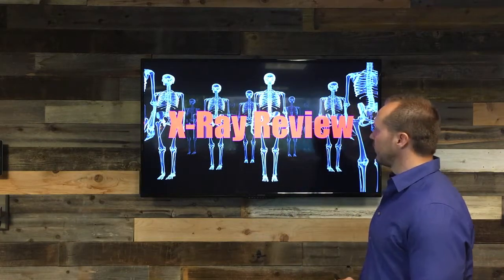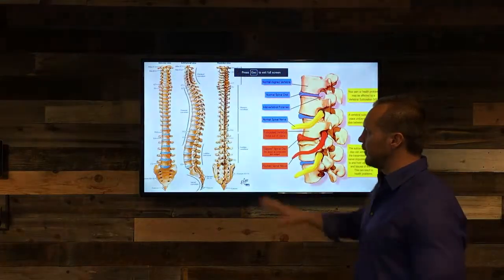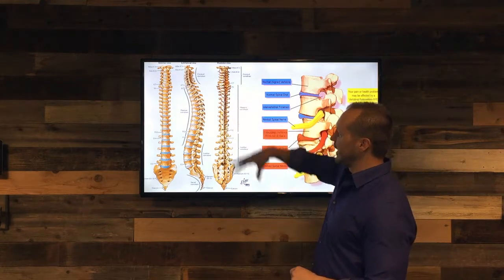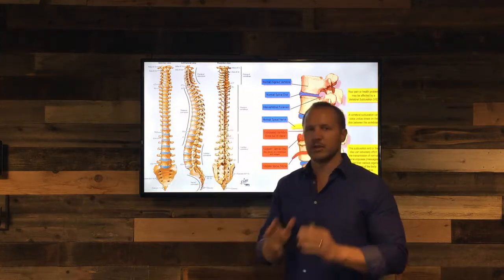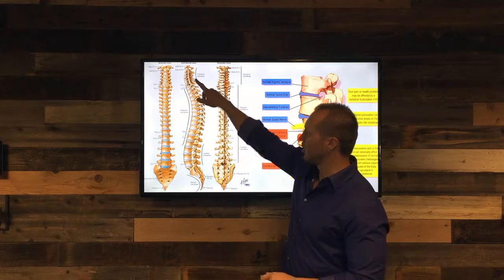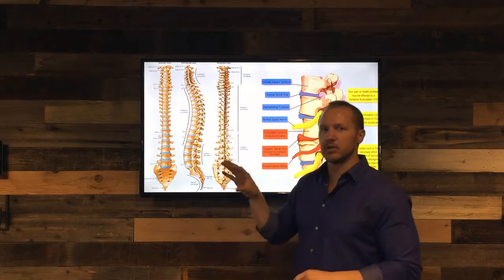So the x-ray review, we're going to go over different aspects of your x-rays. I'm going to try to do this as quickly as I can, but if you remember from the first visit, we talked about the alignment of your spine and how important that is. Now, if you remember, from the back or from the front, your spine should be straight. From the side, you should have this S-shaped curve. No matter what reference you Google when it comes to the skeletal structure, this is how it should be.